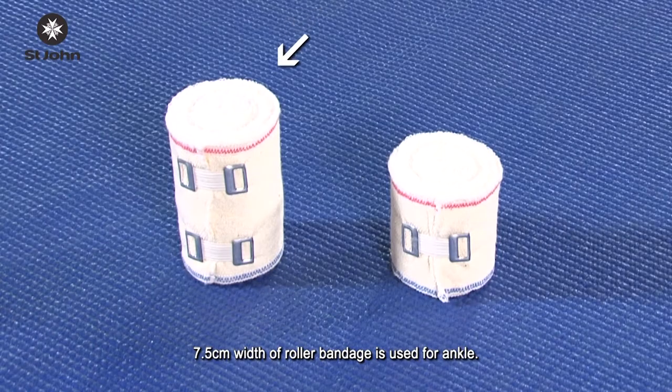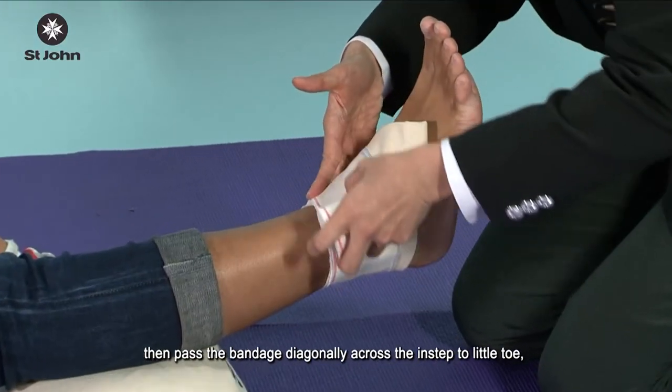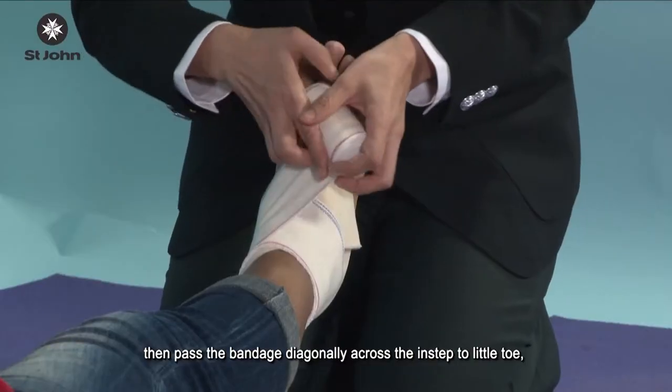A 7.5 cm width roller bandage is used for the ankle. Firstly, make a straight turn at the ankle, then pass the bandage diagonally across the instep to the little toe.